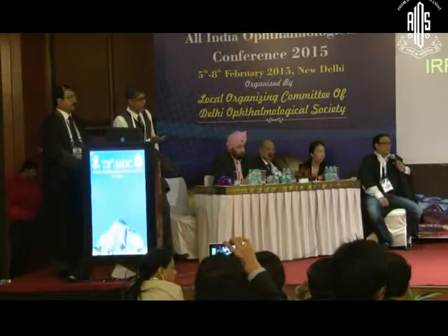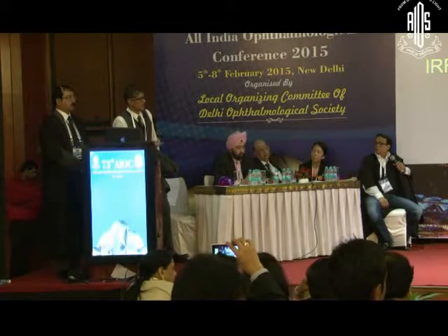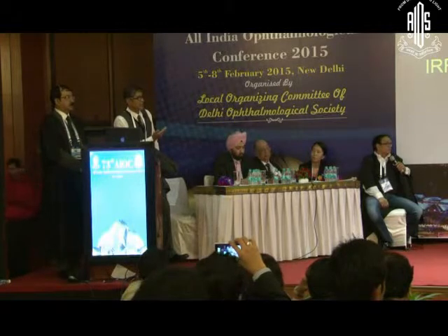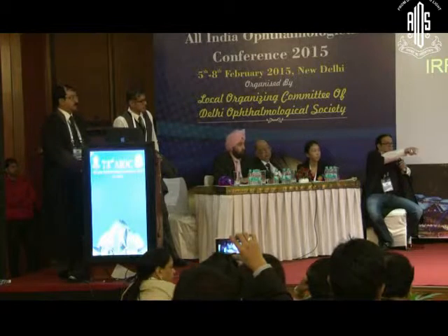Interlenticular opacification is a big problem, and it is very difficult to treat. But if you have an ICL, you don't have that risk. Here I was still able to maintain the ICL, not remove it. Let's get some more, maintaining the ICL.